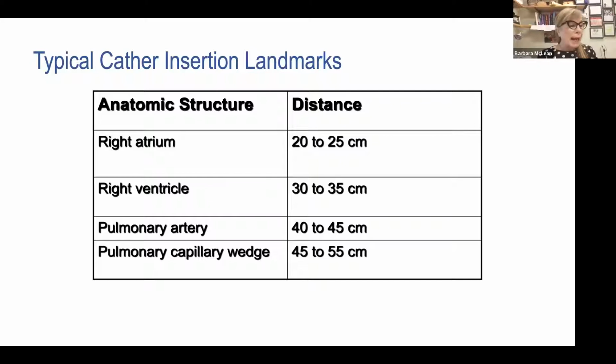Now, when the PA catheter, my job here isn't really to talk about setting up for flotation, although I'm happy to do it. But just to remind you that during insertion, there are some very important aspects here. Your catheter comes out of the box with this nice curve. That curve should actually be pointing towards the foot and towards the patient's left-hand side. So when your doctor starts to put that catheter into his introducer, it shouldn't be turned upwards or turned towards the right.